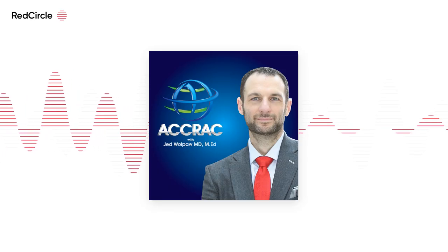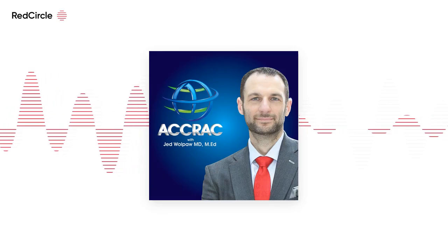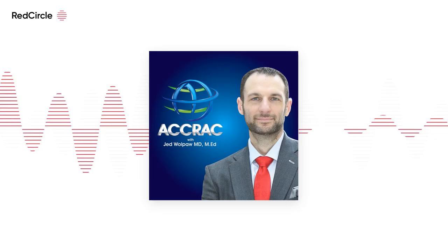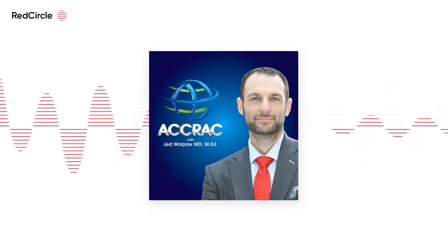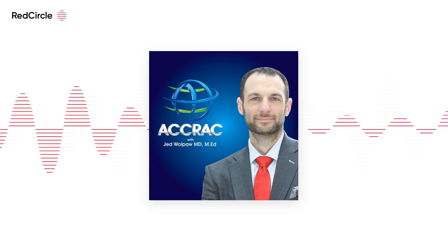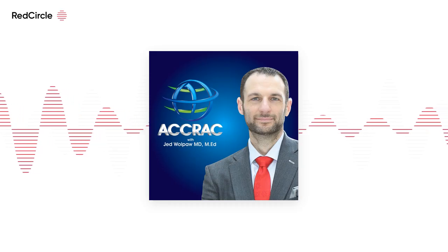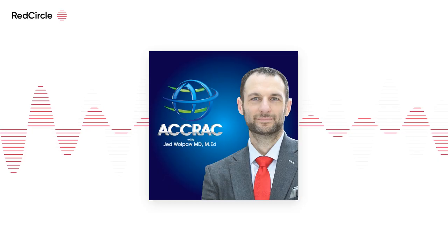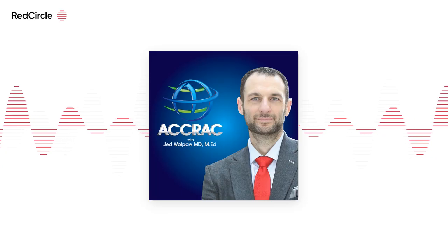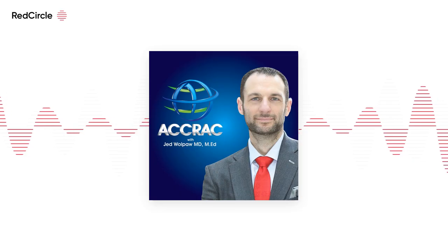But as you're watching compliance, the question is, do you wait until the compliance is the best it possibly can? Typically, we used to do that and then go +2. The reason being is that CT studies had shown that at the highest compliance, there were areas of collapse. EIT studies are showing the exact same thing, that at optimal compliance, you have more collapse. So whether it's best compliance +2, all we know right now is that all of the studies that have utilized compliance in a decremental PEEP trial have either been stopped early for futility or showed harm, like the ART trial that had over 1,100 patients in it.